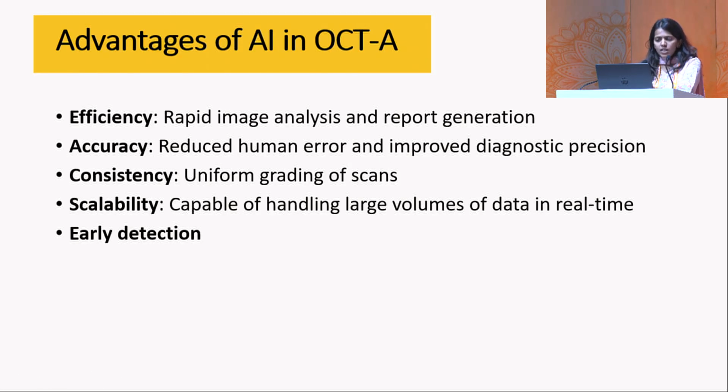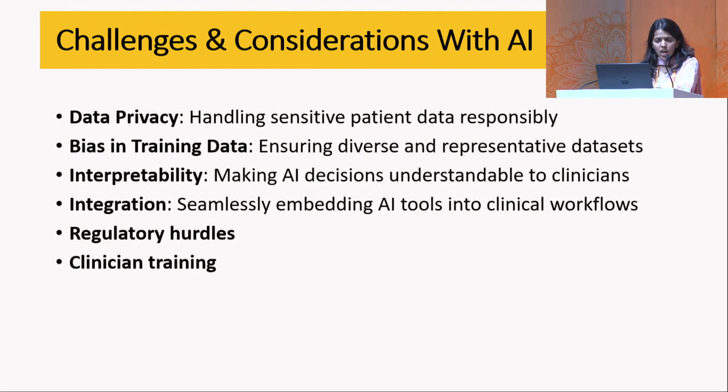So AI in OCT angio improves not only efficiency, but also accuracy. Obviously, it reduces human error and improves diagnostic precision. It improves consistency by uniform grading of scans, increases scalability by handling large volumes of data in real time, and it can detect a lot of pathologies early. However, there are certain challenges and considerations that come with AI, which are, of course, data privacy, bias in training data, interpretability, making AI decisions understandable to clinicians, integration of AI tools with clinical workflows, regulatory hurdles, and clinician training.